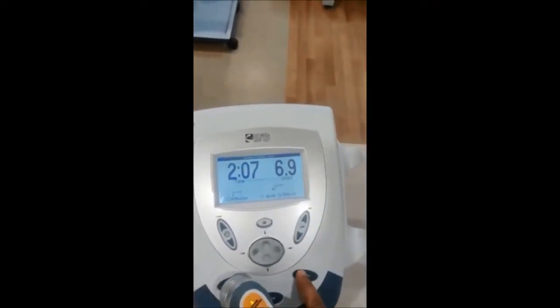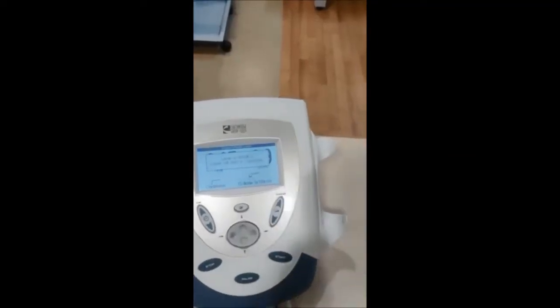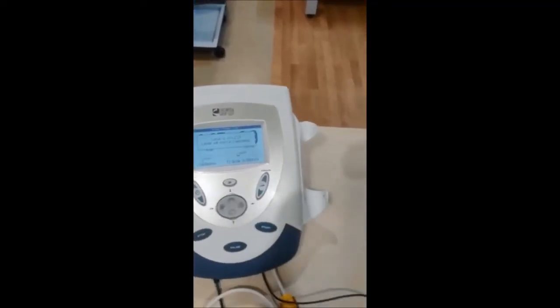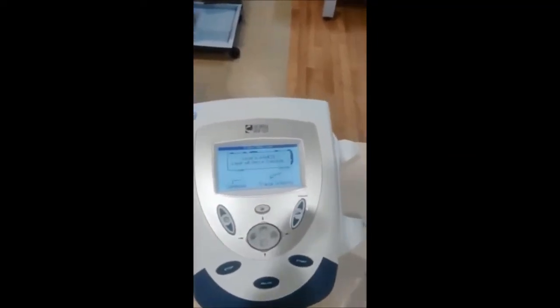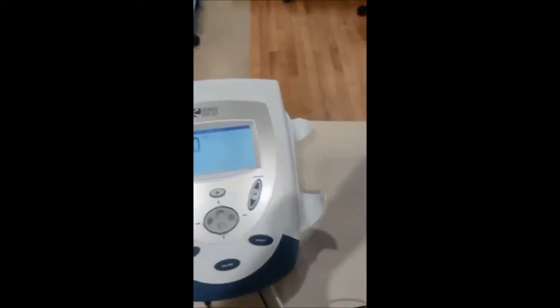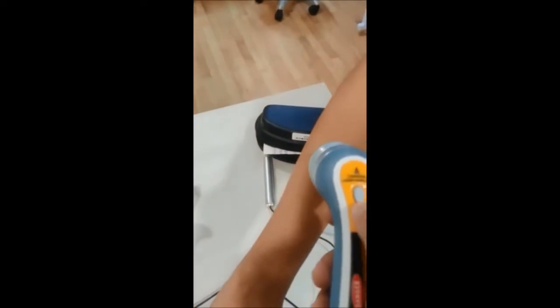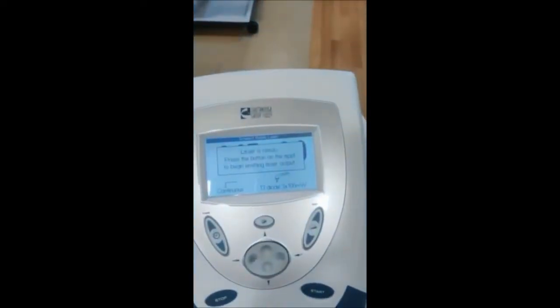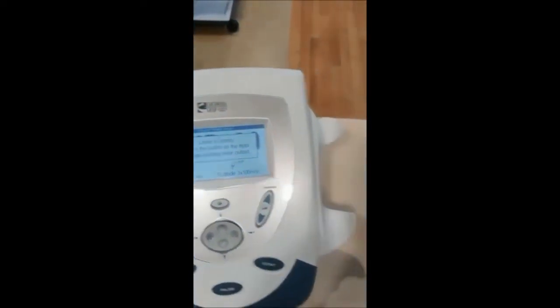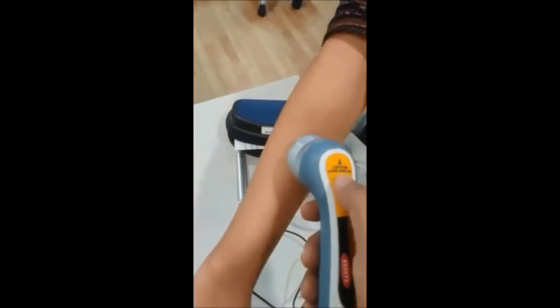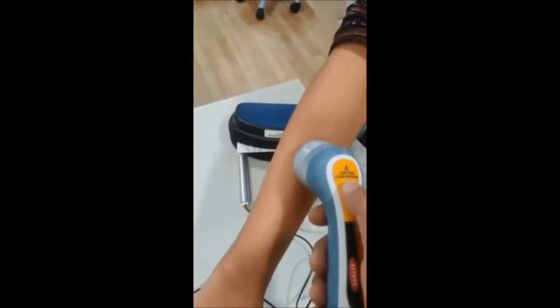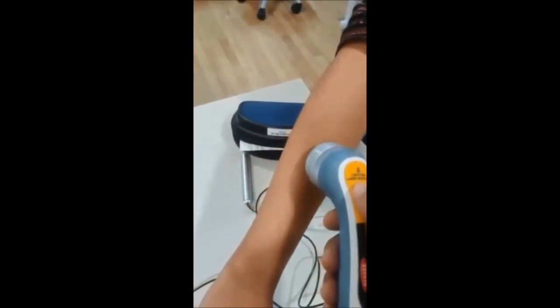Now you can press start. It is showing laser is armed. You have a button here also. Laser is ready. Now we will begin the treatment. You have to wear the goggles first.